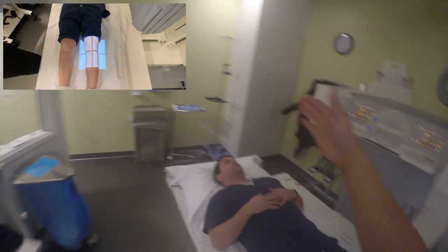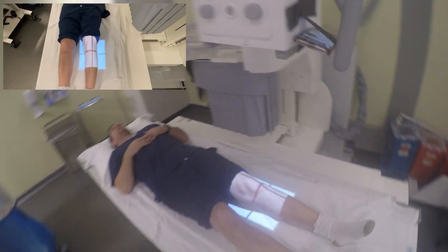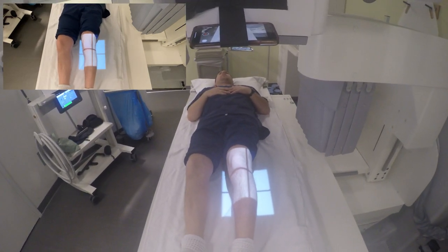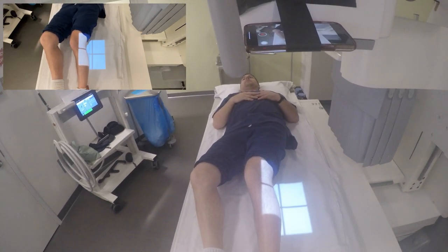So your knee is straight up to the ceiling. I need you to rotate inward at a 45-degree angle — you may need to rotate your hips for that a little bit. There you go, keep on going, right there — good, great. Hold still right there for me. Sorry, I know it's uncomfortable.